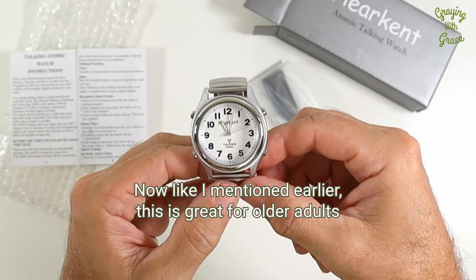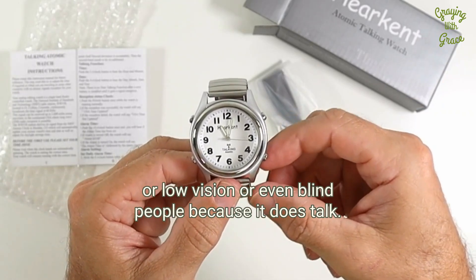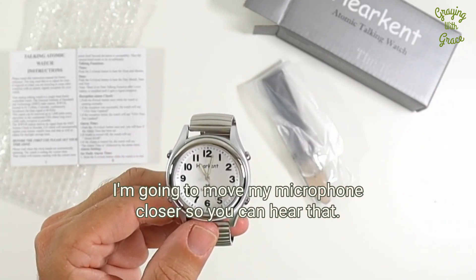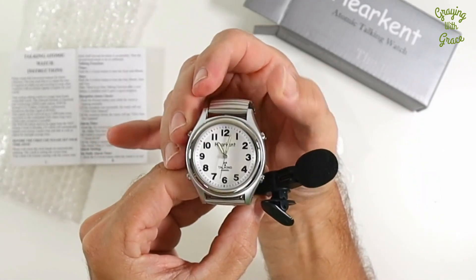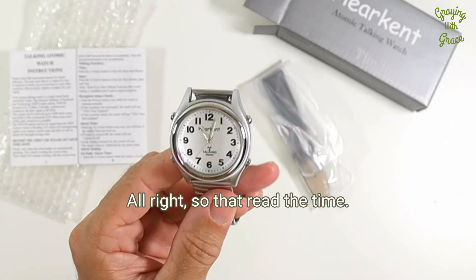As I mentioned earlier, this is great for older adults with low vision or even blind people because it does talk. If you want to know the current time, you press the 2 button. So that read the time.